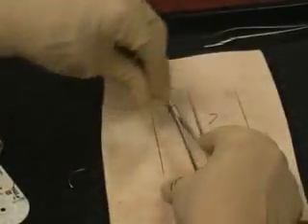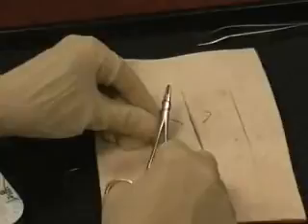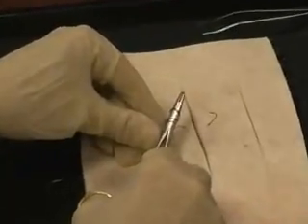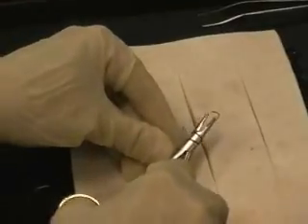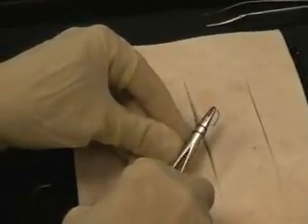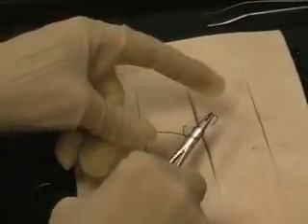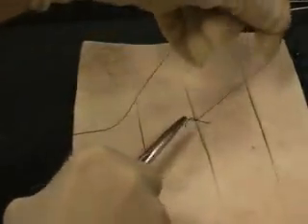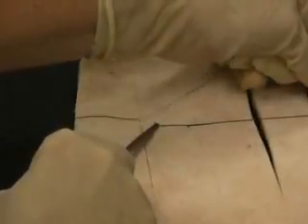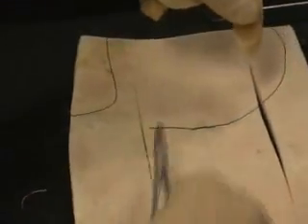We're going to go over 2 times. The reason we're doing 2 times is because we really want this to hold well, and we're placing a surgeon's knot as our first knot. We're going to grasp the tip of the suture, and we're going to trade sides. So the little side is coming over here, and the long side is going over there. You can see that, and we come down exactly perpendicular to the wound, okay?